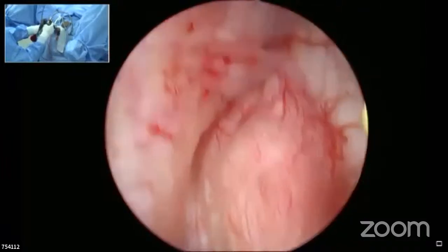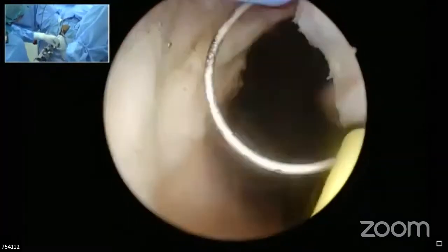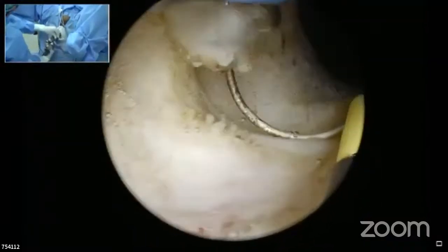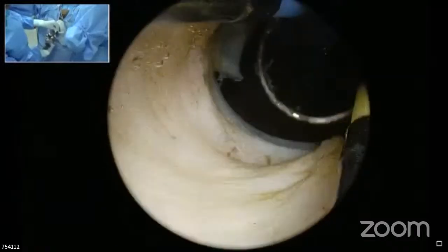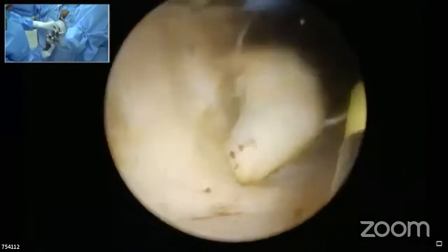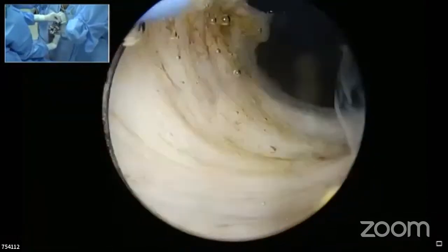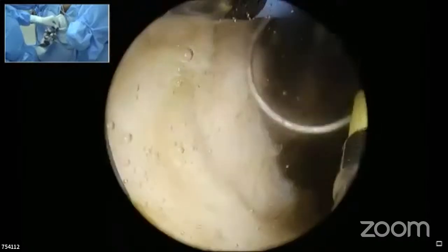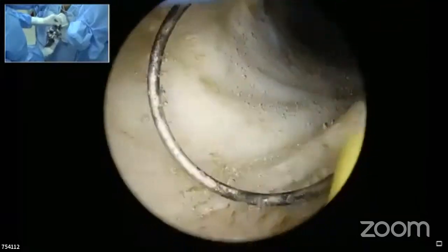So coming back, reorienting myself. So I have not overshot. I go back again marginally inside for an additional margin of safety. So from 12 to 9, fair amount of detachment of the gland.